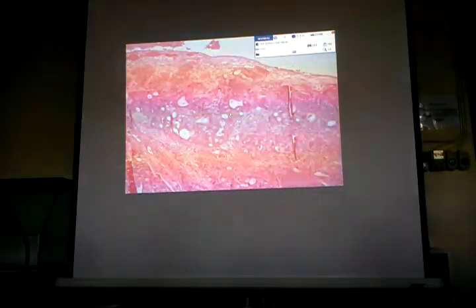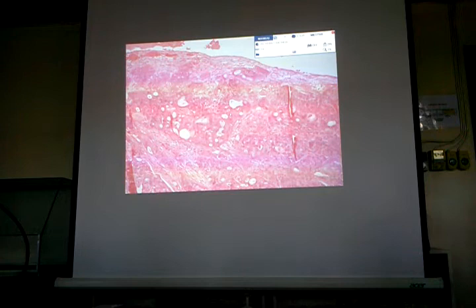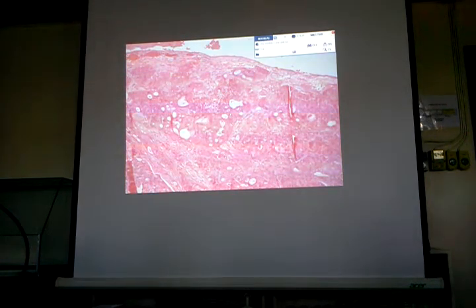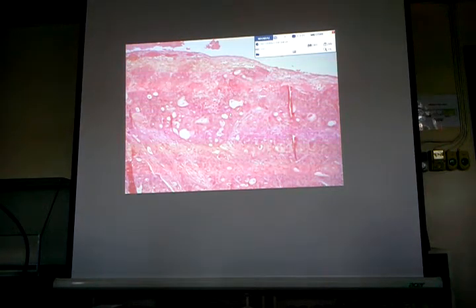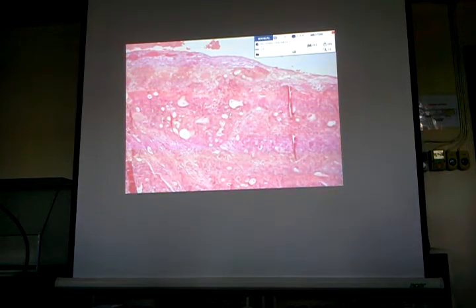And then in this portion of the tumor, we are able to see glands. Okay? Meron kong mga lumen. And then contained within the lumen is mucous material. Okay? And then if we examine the cells lining the glands, we will be able to appreciate mucin vacuoles in their cytoplasm. So aside from the squamous epithelial cells, we are also seeing mucus secreting cells. So that's the name of this neoplasm, mucoepidermoid carcinoma.